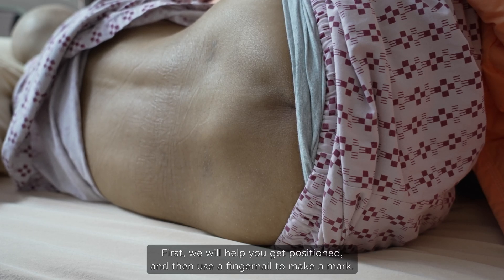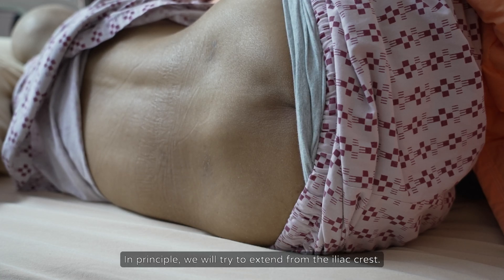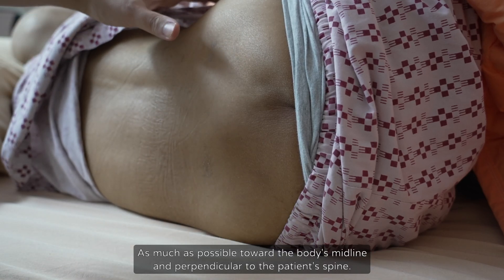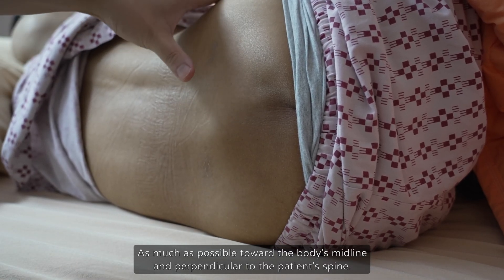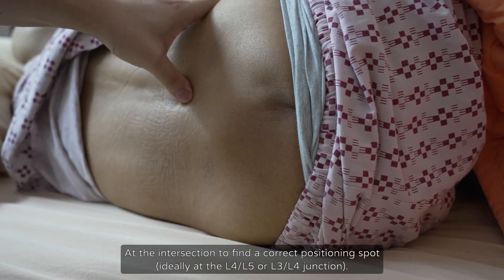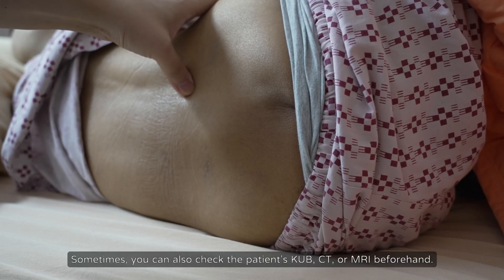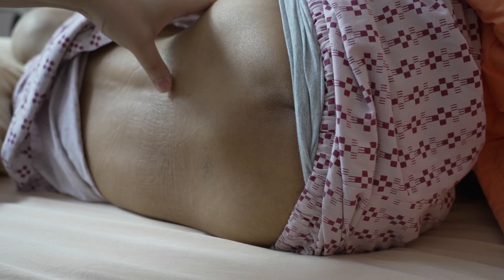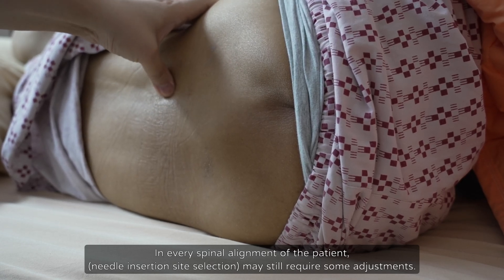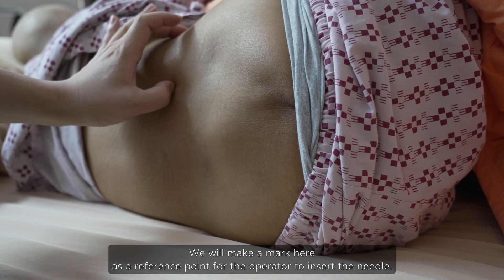First, we will help you get positioned, and then use a fingernail to make a mark. Please let us know anytime if you feel uncomfortable. In principle, we will try to extend from the iliac crest as much as possible toward the body's midline and perpendicular to the patient's spine at the intersection to find a correct positioning spot, ideally at the L4-L5 or L3-L4 junction. Sometimes you can also check the patient's CT or MRI beforehand. In every spinal alignment, the needle insertion site selection may still require some adjustments. We will make a mark here as a reference point for the operator to insert the needle.